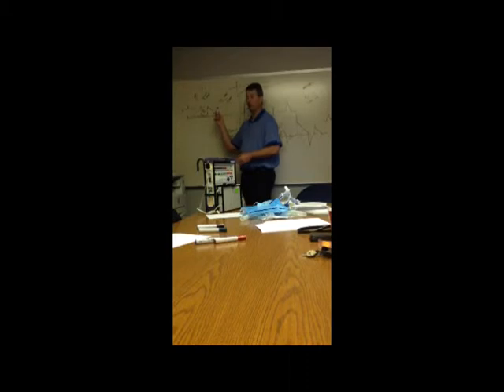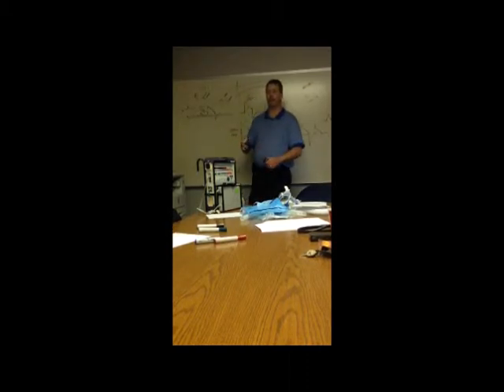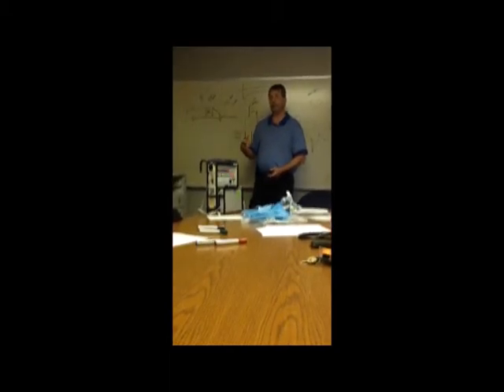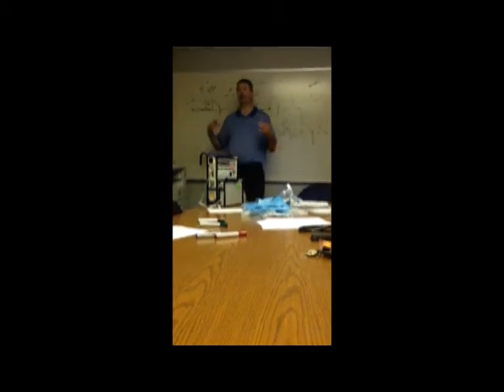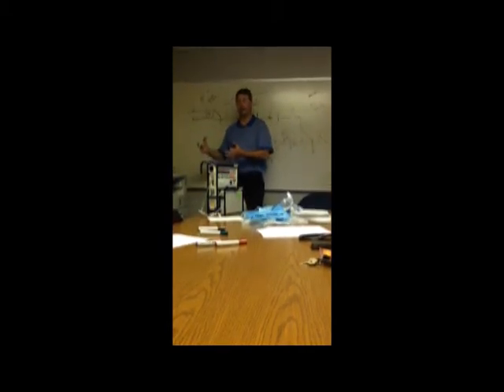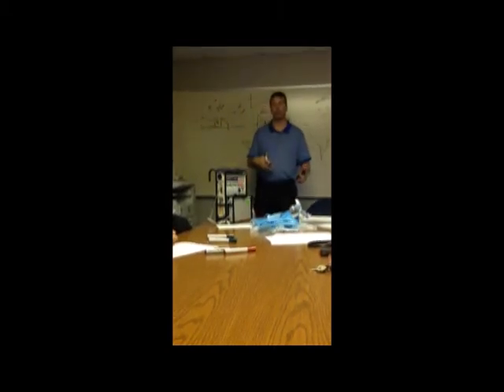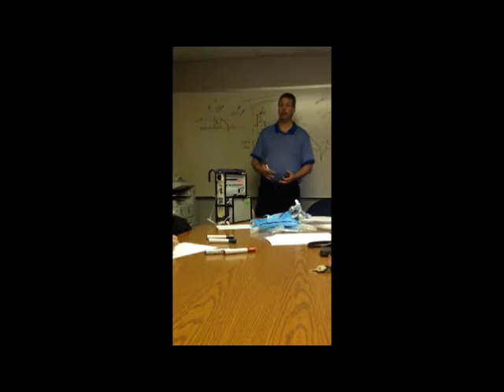The only thing that's going to help is increasing how much I'm opening them up with PEEP. So you don't use IPAP ever to work on fixing an oxygen problem unless their tidal volumes are low. If their SAT's 80, they're on 100%, and their tidal volume's 200, yeah, I would try to improve their tidal volume first to bring up their oxygen. It's the only time that that's used for that, is if they're hypoventilated. You're not getting enough air in and out. Once you get to where you've got that tidal volume to a normal thing, going up any farther is not going to help.